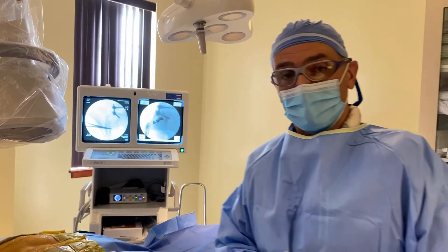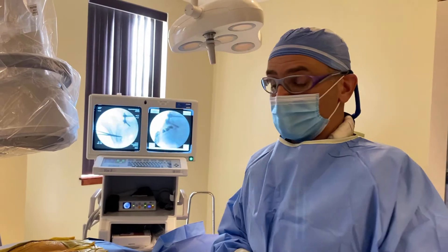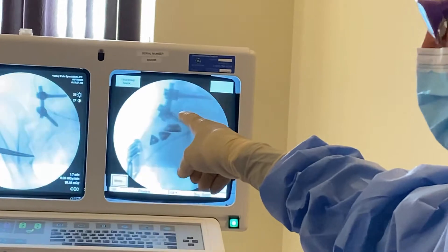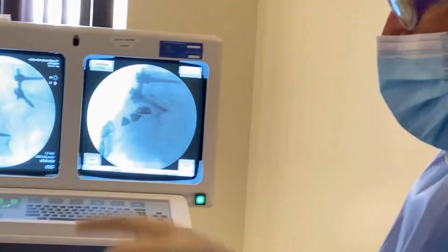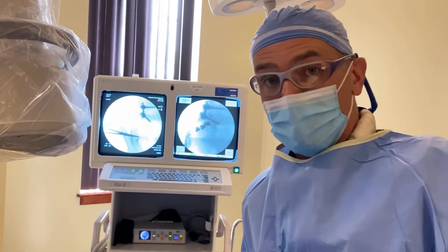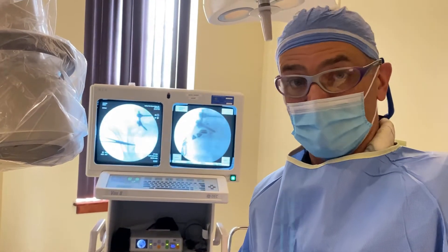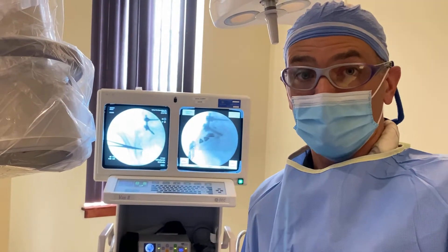We're back in the treatment area now. The patient is under a light anesthetic and we've marked out the SI joint on fluoroscopy. On the screen, the tip of that marker or clamp is pointing to the bottom or inferior pole of the sacroiliac joint, and that is where one of the implants will go. The other one will go about three inches above that.